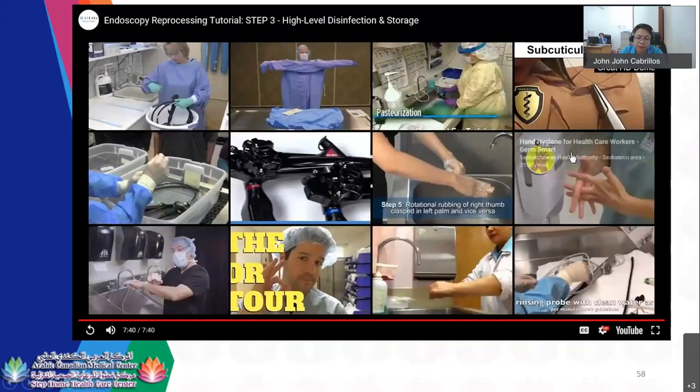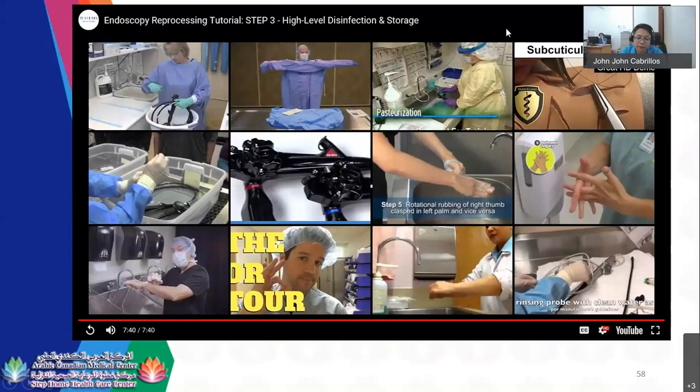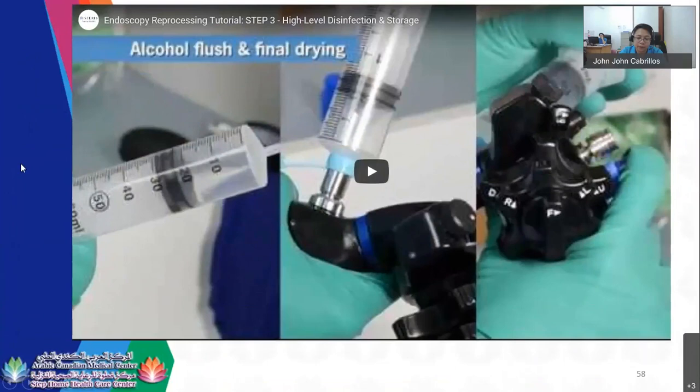So guys, that's the process of your high-level disinfection and storage. For your storage, as you can see, it needs to be in your storage cabinet before transporting your instruments to the OR. If your surgeon doesn't need the endoscope, you are not allowed to put the endoscope in the carrying case for storage, which means the carrying case should be used only once you need to transport or deliver the endoscope for a procedure. So please be reminded, there are two chemicals used, which are glutaraldehyde and alcohol.